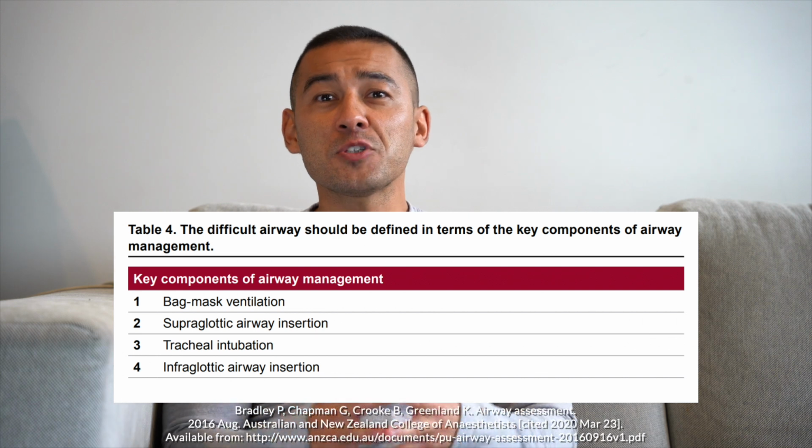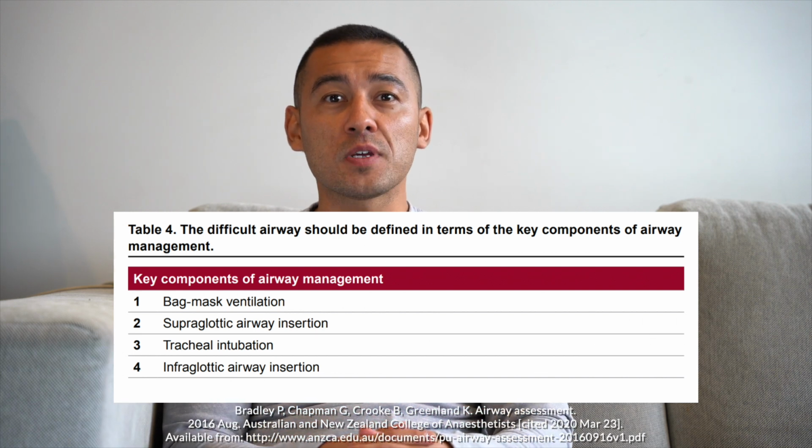After all, some intubations may require using all four of these interventions, and it is therefore crucial to identify factors that make performing any of them difficult. This is extremely important to allow for early strategic planning to improve first-pass success, reduce the risk of complications, and if needed, make an informed decision to not proceed with intubation altogether.